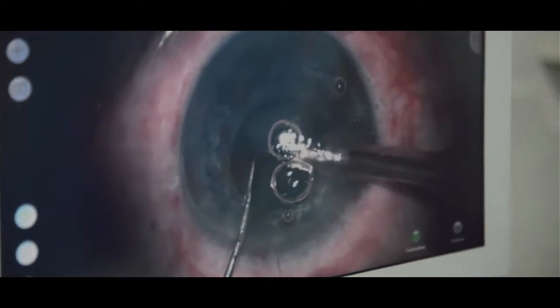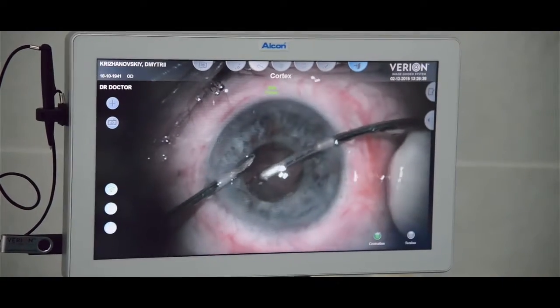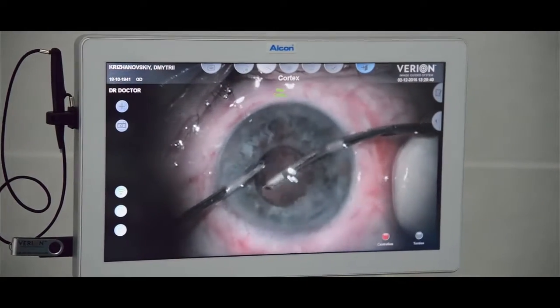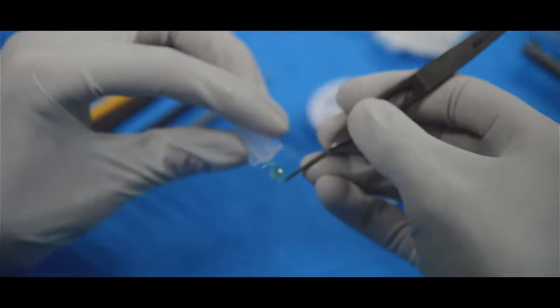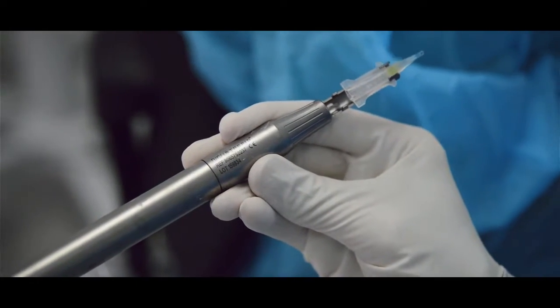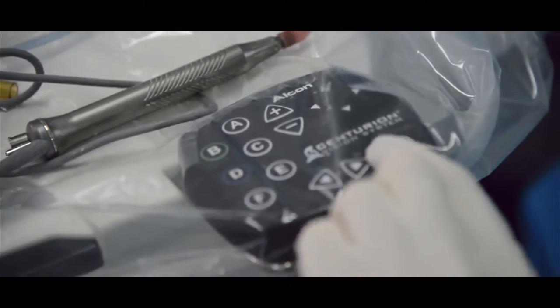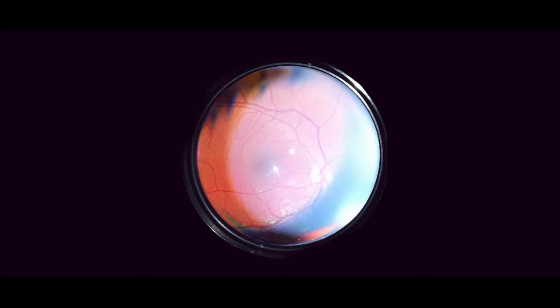Phacoemulsification was performed using the phaco chop technique. The lens masses were aspirated using a bimanual aspiration irrigation system. Implantation of the Alcon IOL was carried out using the AutoSert IOL automated injector. On the first post-operative day, the uncorrected visual acuity was 20/30.